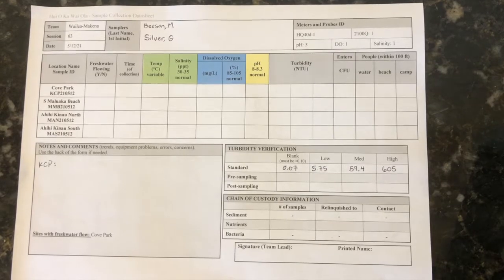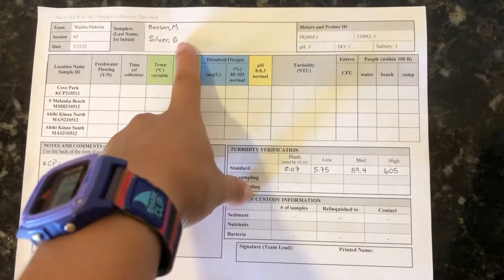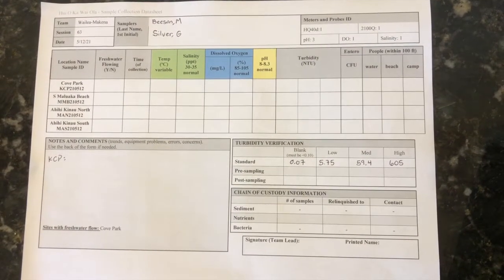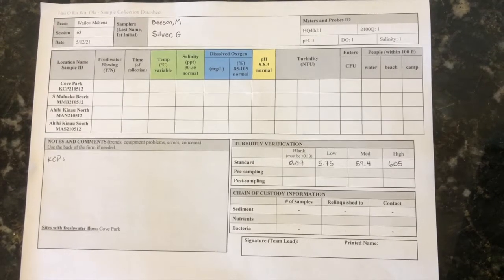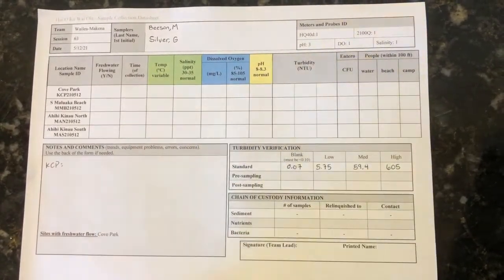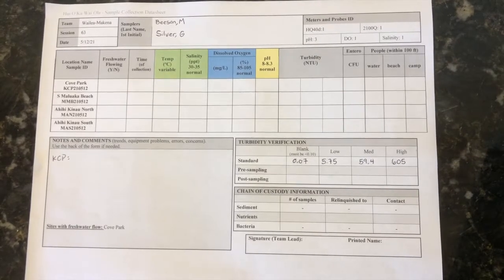In the morning before sampling starts, be sure to write all volunteers' names on the datasheet in the appropriate box. The date, sampling team, equipment, and site IDs will already be filled out by the team lead. Make sure to record values for all of the parameters on the datasheet. It is helpful if you can keep your handwriting small and neat so there is no question about what value has been written on the sheet.